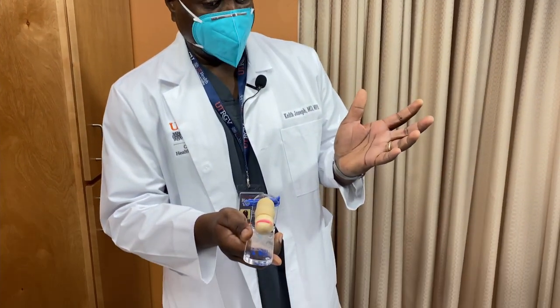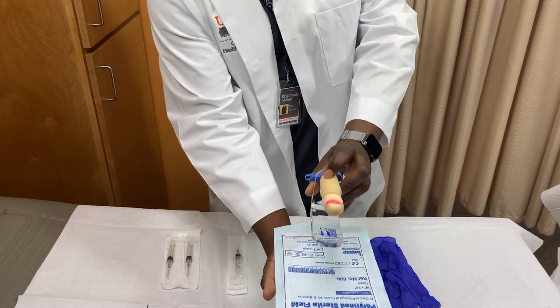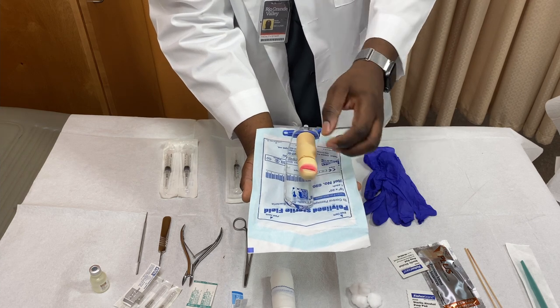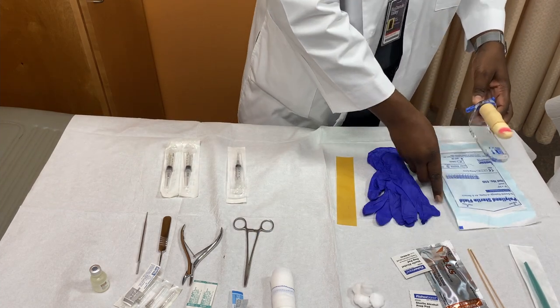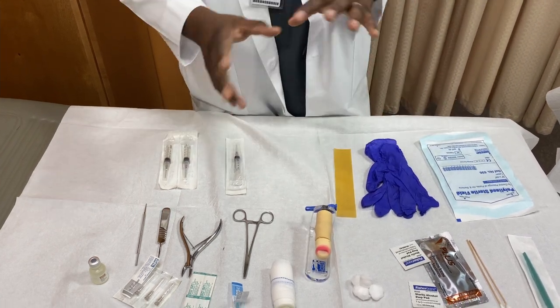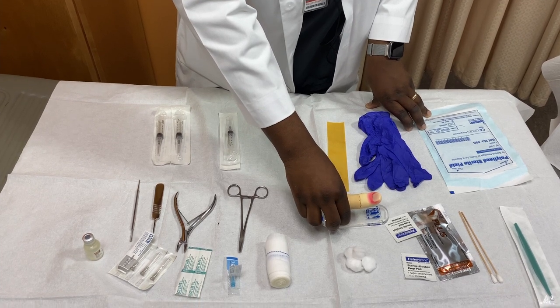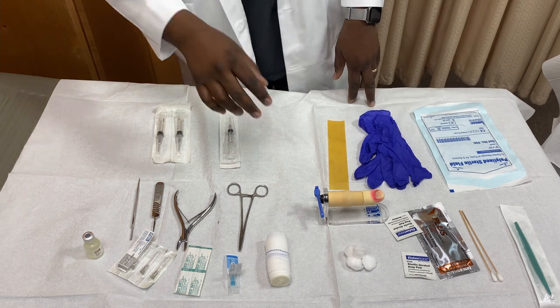After obtaining informed consent, proceed to gather your equipment and position the patient. You want to make sure the digit is flat on the surface of the drape. Your non-dominant hand will stabilize the toe, and your dominant hand will perform the nerve block. You can have the patient in the dorsal recumbent position with their feet on a flat surface, or sitting up with their feet dangling off the side of the exam table — in that case you'll need to stabilize their digit even more. It's your preference.